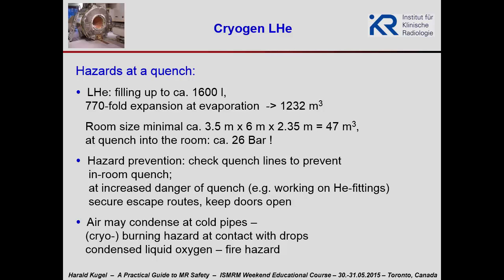So to prevent this, you have to check the quench lines leading the evaporated liquid helium outside. If you have an increased danger of a quench, for example, if people work on the helium fittings, then you should secure escape routes and keep doors open to be able to run away if an in-room quench actually happens. Also, if a quench occurs, even if everything is okay in intact quench lines, air may condense at the cold pipes, and you have a cryo-burning hazard if you contact the drops, because these drops are not water but condensed liquid oxygen. This increases the fire hazard again, and it also causes cryo burns. So you should go away from this.